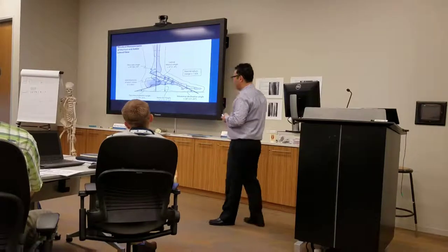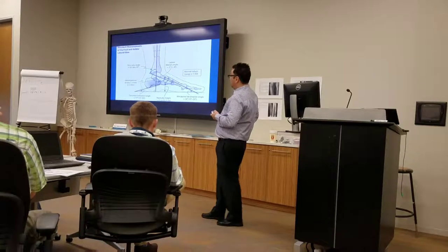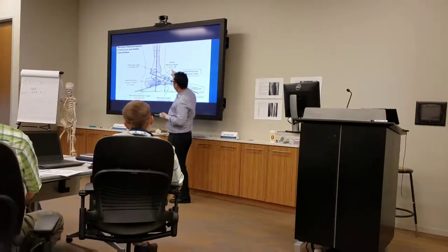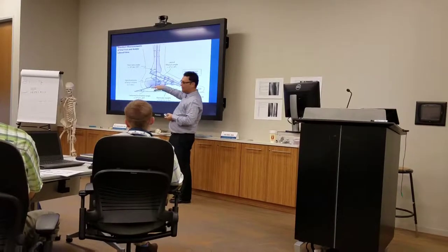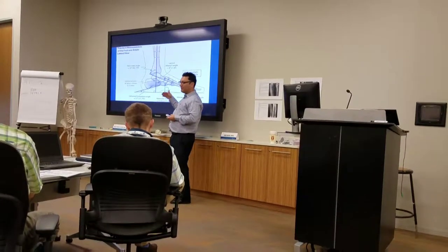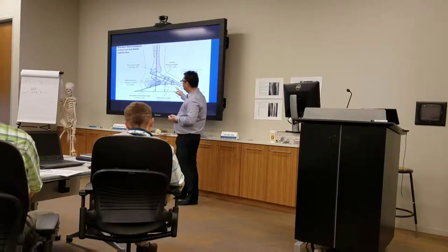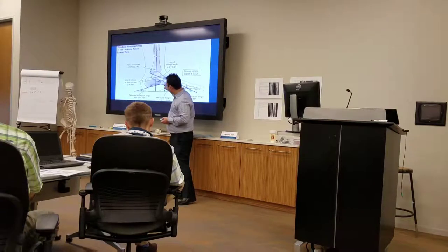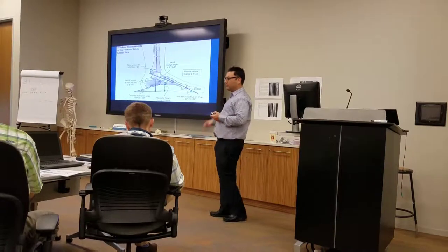This is out of the book that's given out at the Baltimore course on your regular angles. Typically with the Charcot, what you're going to see is that the lateral Meary's angle is 5 degrees? I'm sorry, I said 6 before. So it means it's 5 degrees in cavus. So if you have a 10-degree deformity of Meary's angle, it's really 15 degrees. But you'll notice a lot of times it's breaking the Meary's angle, and what happens is the navicular height drops down. Those are the things you're kind of looking out for to try to correct.